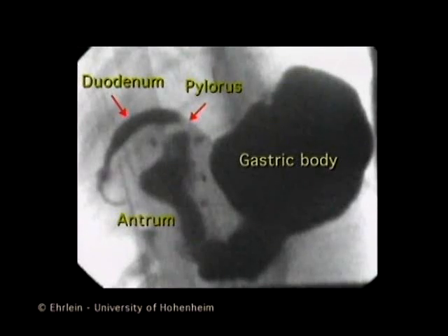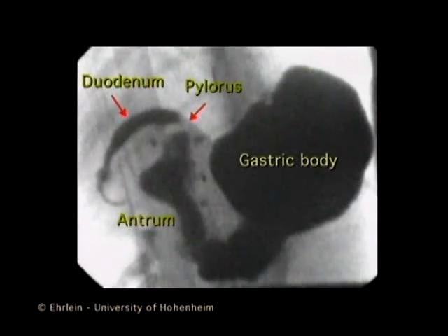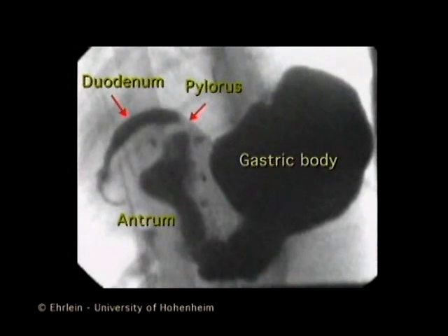Here you can see the fluoroscopic picture of the gastric body, the antrum, the pylorus and the duodenum.